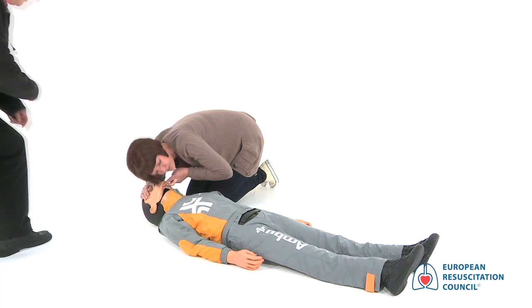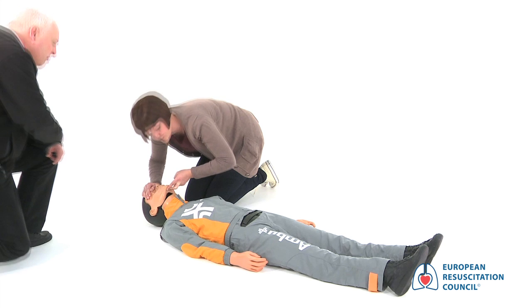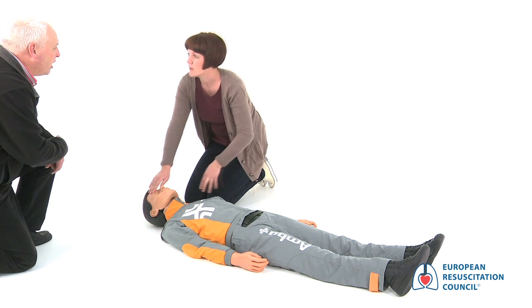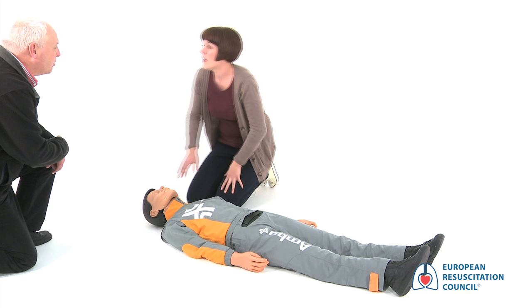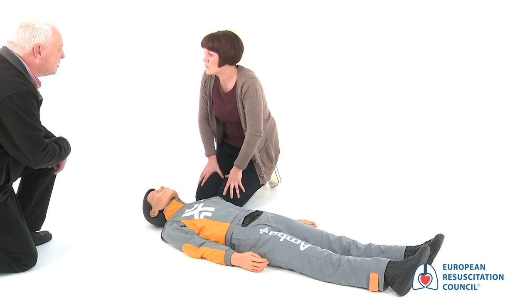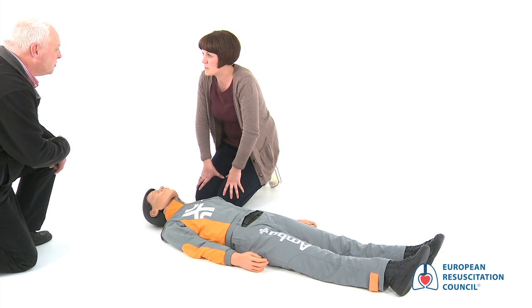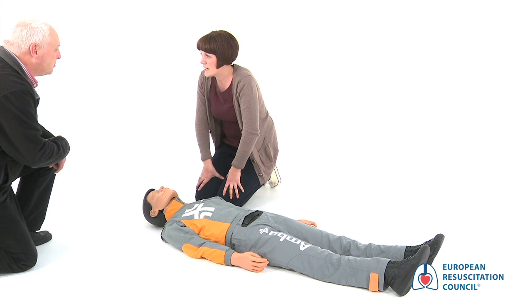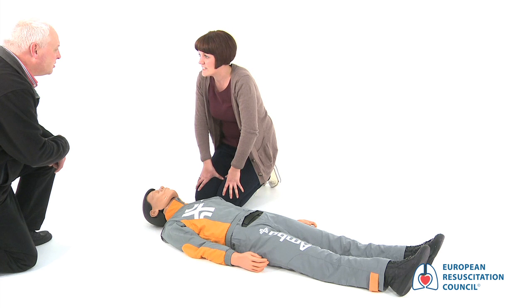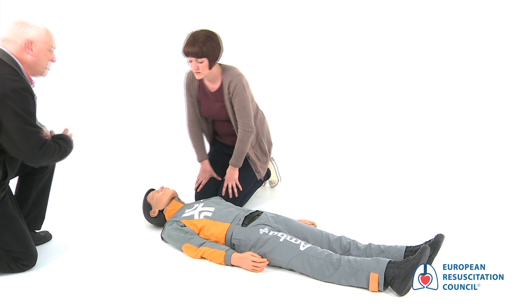If the victim is not breathing or not breathing normally, ask a bystander to call the emergency number for an ambulance and to bring an AED immediately when available. If no bystander is available, make the call yourself. Use your mobile phone if possible.